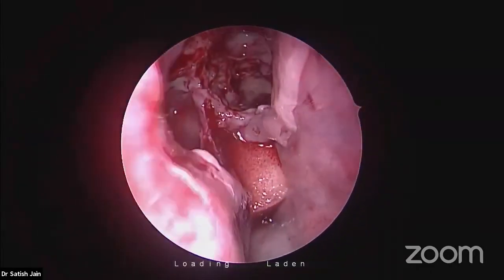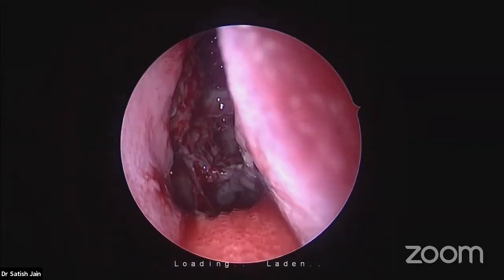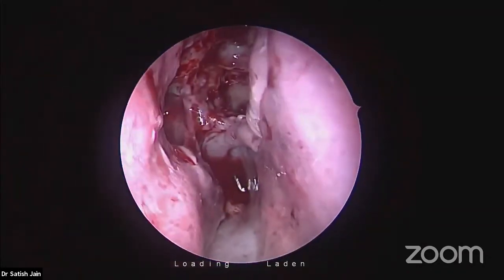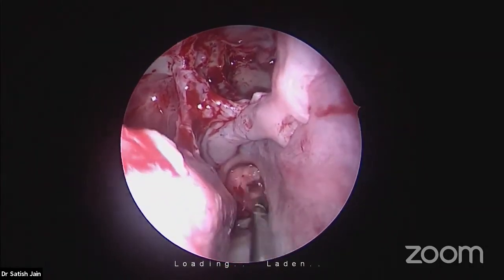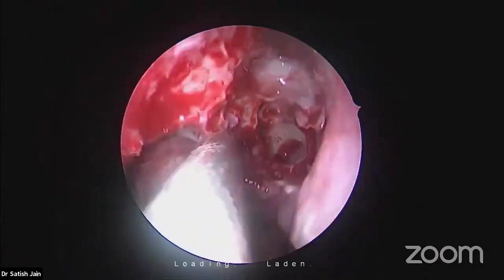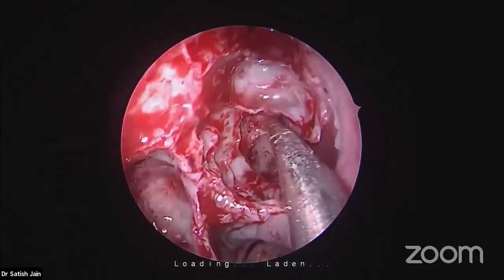The goal of surgery is two-pronged, to do a complete work addressing all sinuses. That's why we call it full house safe FESS. At the same time preventing complication, and so many landmarks we take into consideration to prevent complication. Right from the beginning, every step you need a good landmark.